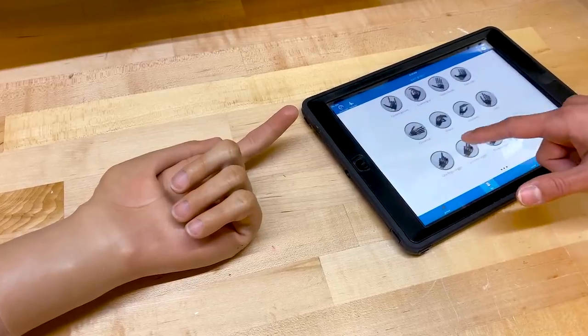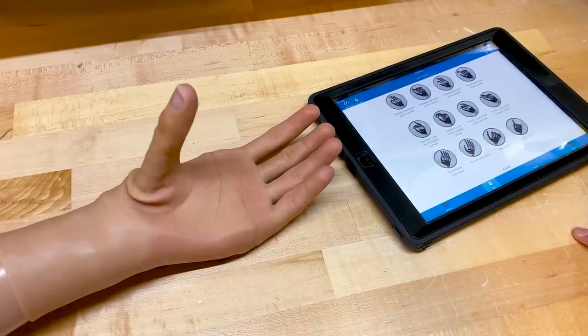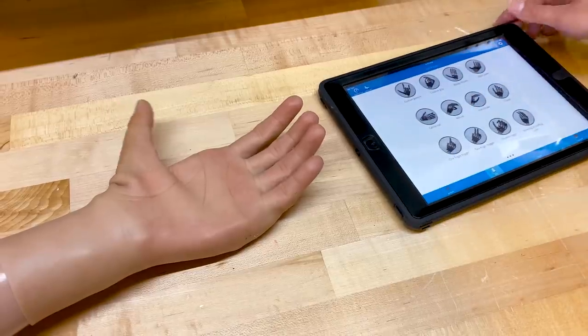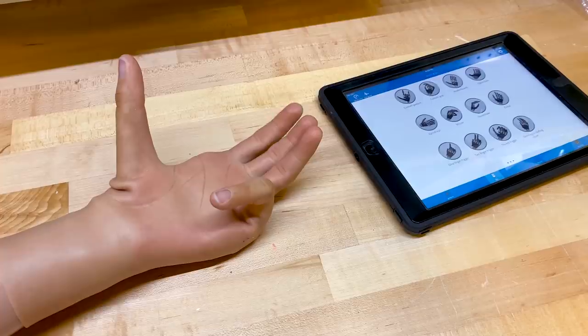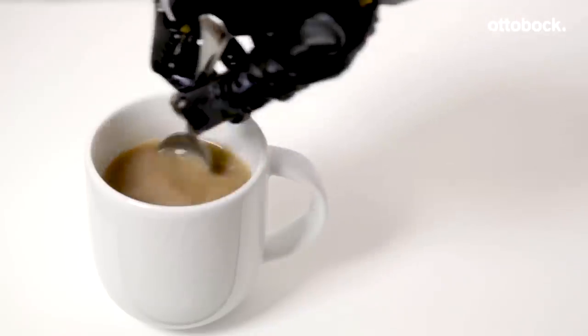Now, this is my favorite part. By hooking up the prosthetic to a tablet, we can more easily test and program different hand functions. So, for example, making a fist, or pointing. And this is a special grip for using a computer mouse. And you can even see how the index finger moves to click the mouse. This opens up so many opportunities for people using these devices, which is really amazing to see.